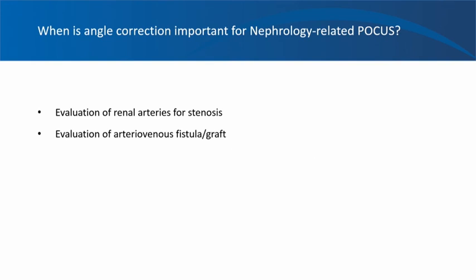And the second thing is, if you are evaluating the arteriovenous fistula or graft, yes, then angle correction is important. So in your point of care practice, you might want to evaluate an AV fistula for maturation and also see if there are any major issues with the flow. So for this purpose, you need to keep in mind the angle correction.